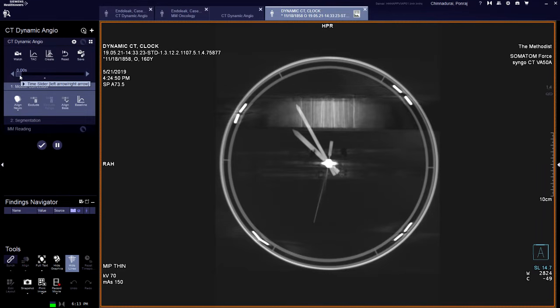So instead of imaging at, say, 12 o'clock and 12:15 and 12:50, taking a guess, we are taking pictures every 3 seconds. And as I move this slider here, I'm going through 2.5 seconds, 5 seconds, 10. So you can see the clock moving, right? So this is the concept. In theory, this is what is happening, and this is what we are able to generate.